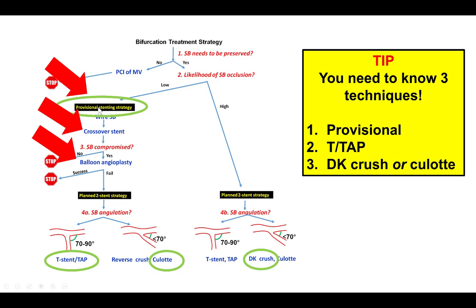This is a case of provisional stenting in which a stent was placed over the ostium of the side branch. The side branch became compromised as shown by the pressure wire, and that was solved by doing balloon angioplasty, kissing balloon inflation, and re-POT.